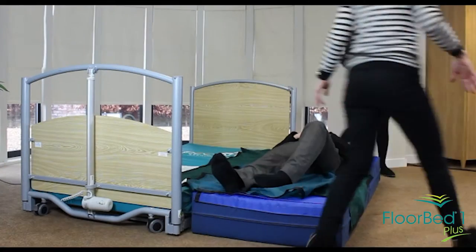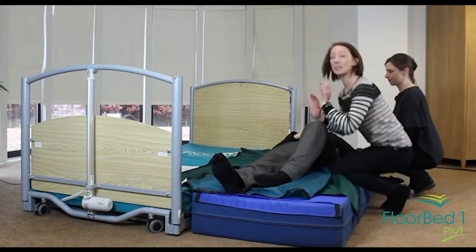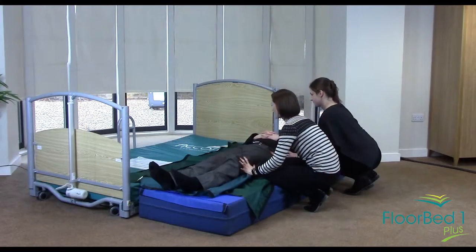At this point we would come back round the side of the bed, get into position, and then slide the mat onto the bed. One, two, three — slide.